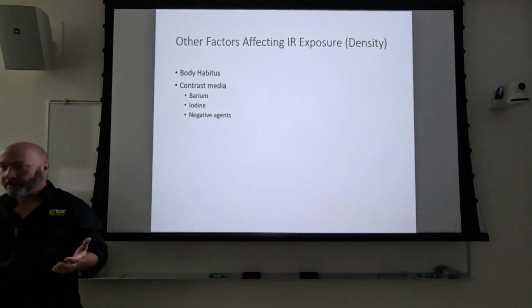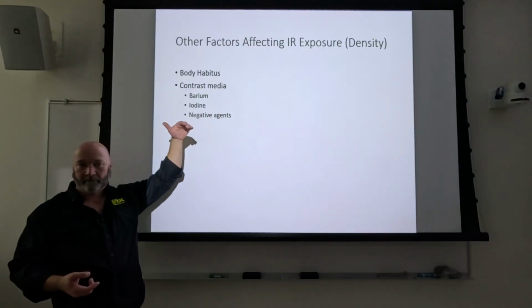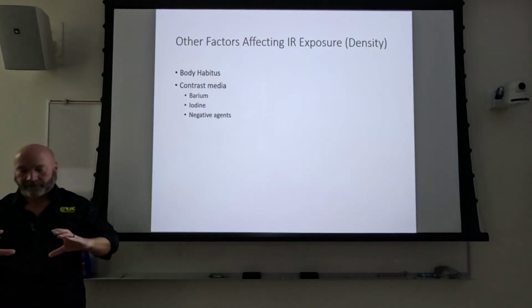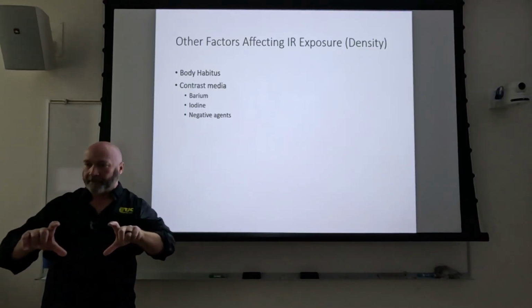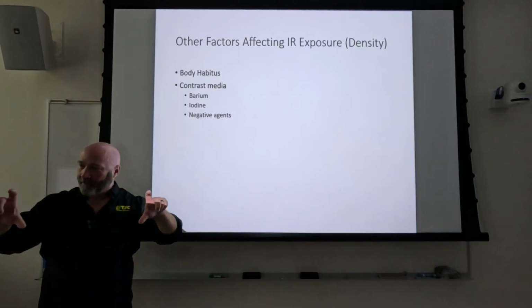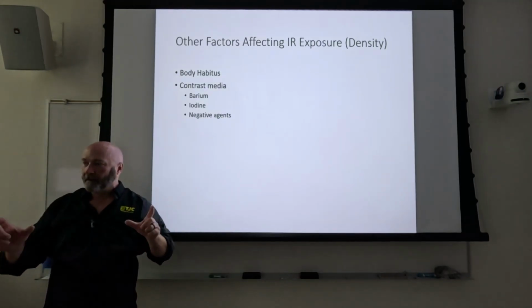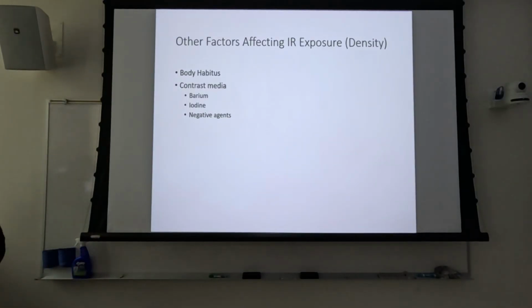So carrying that out to barium, the quantity in solution is even much higher than either one of those, right? So you mix up barium, you've got that bag for an air contrast barium enema, and there's that much barium in the bottom of it. And then you put that much water in it, right? So you're 50% barium and 50% water. It's a lot, right? So it's just the amount in suspension. So atomic number wise, very close, within 2. It's just how much do you have within that quantity of liquid.